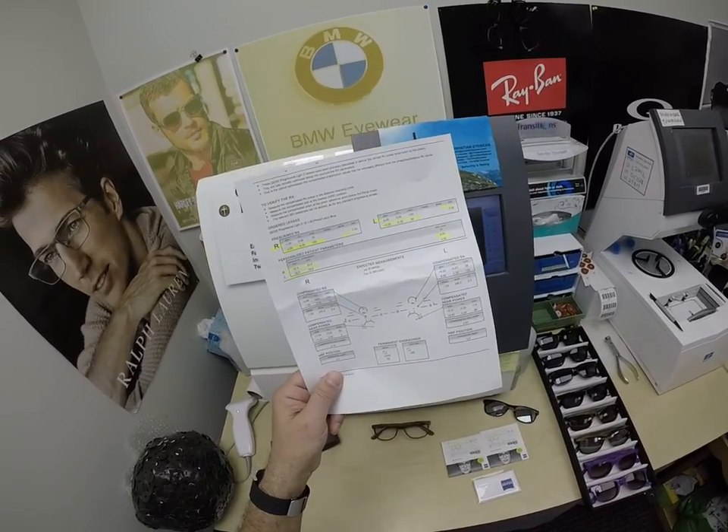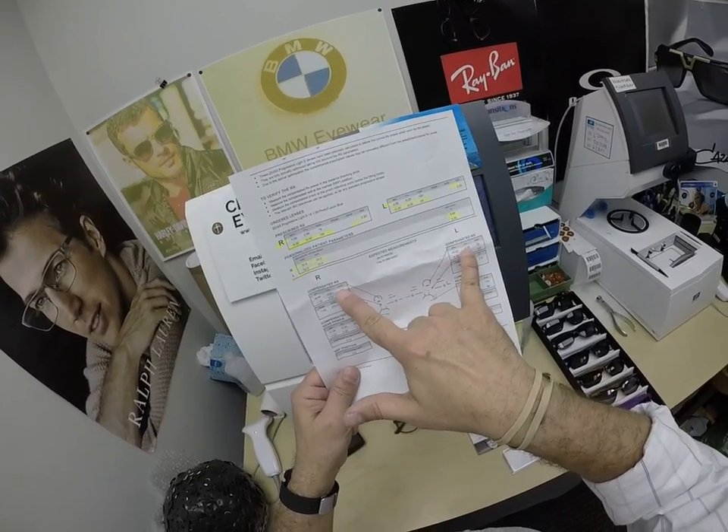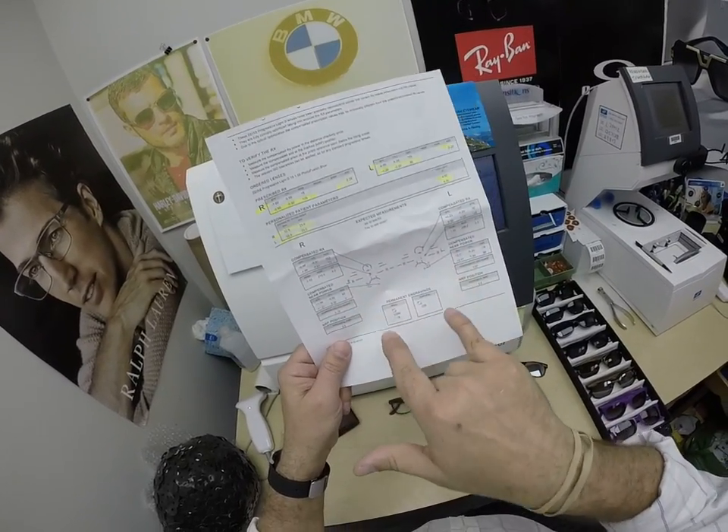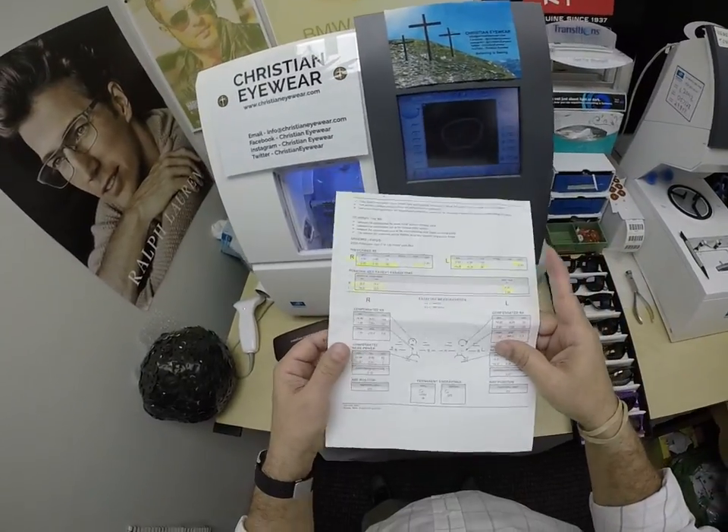Next time you go to the doctor and they casually ask what you're wearing, hand them this piece of paper. It's got a compensated formula for the distance, the intermediate, the near, and the laser engraving showing you where to find them. Your doctor's office will know what all that means.